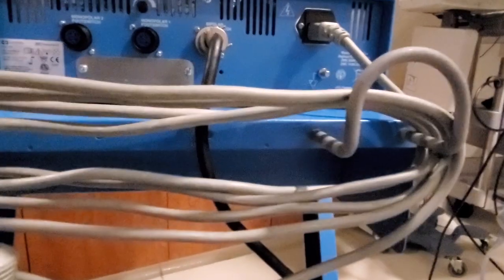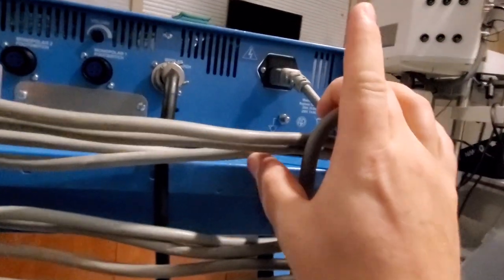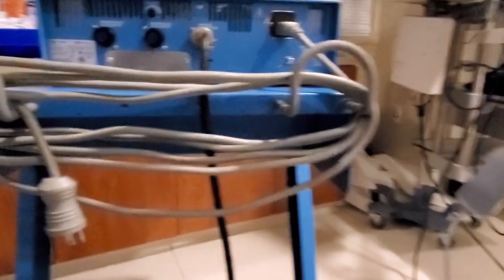So what we like to do, and this ESU cart here is going to be a perfect example. You see how I got this foot control right here? And this, mind you, this video is not just for cath labs. This is for all equipment carts. This is for ultrasound carts, any type of cart where you have stuff attaching to your main unit.